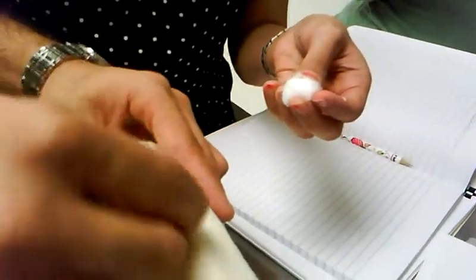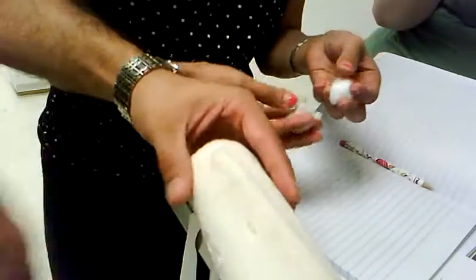Go ahead and scrub. The only time you just scrub right over where you're going to put the catheter, and you scrub around and done. You don't have to scrub underneath here — it's just the top. That's what you do three times.